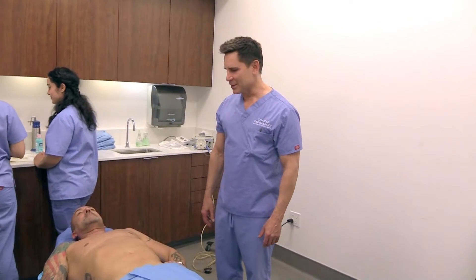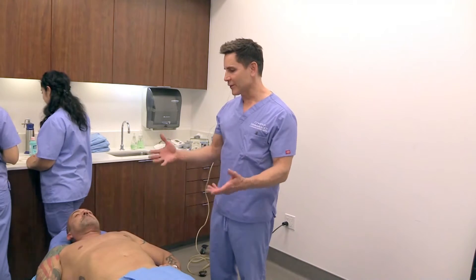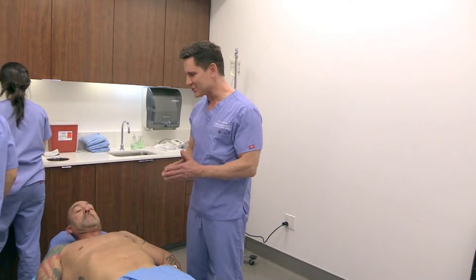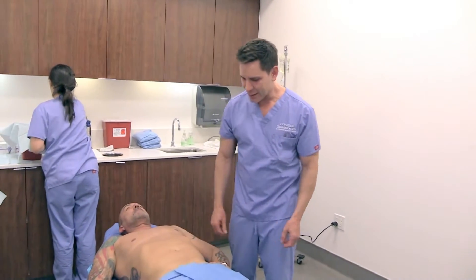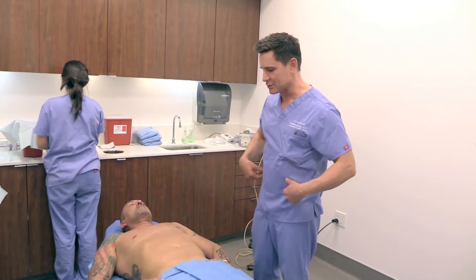Hi, I'm Dr. Tim Doshan. Today we're going to be demonstrating fat transfer. We have a very lean, in-shape patient who makes this a very challenging situation for me. We've sort of pinched around on him — we should all be so lucky to have so little body fat. The only place I can really find fat on our patient today is going to be on his love handle area.